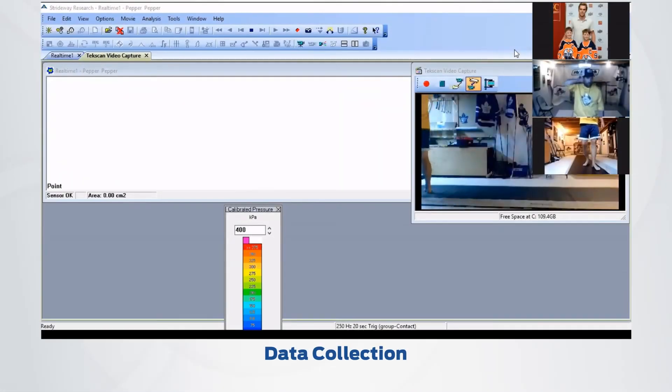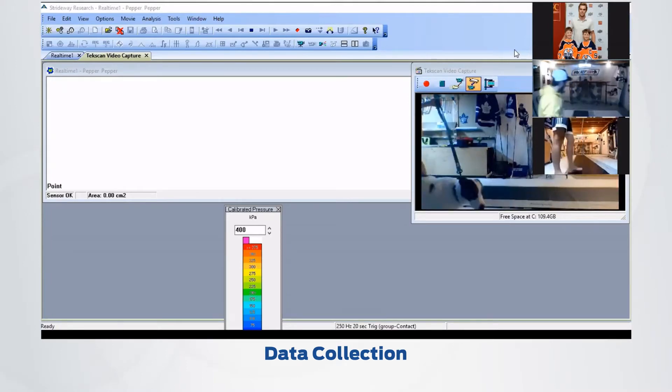We're back with another clip demo. We're going to try and do some data collection with my dog, Pepper. My son is here to help. The Strideway is a very versatile product — it can be used for human gait and for animal gait as well. We're going to try and demonstrate some of that today and provide some treats for our dog. She's a very high-energy border jack breed, so we'll see how well she cooperates.